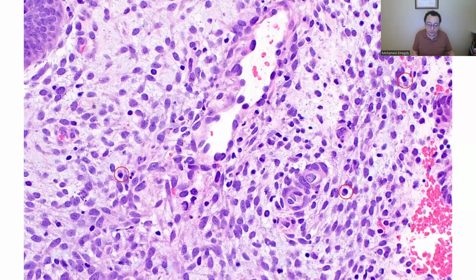Yes. Okay. I try to be as benign as possible. So I highlighted some cells here. Abdurrahman, again, we are going back to Abdurrahman. Well, I don't trust it. I demand a higher power view. No, it's plasma cells.